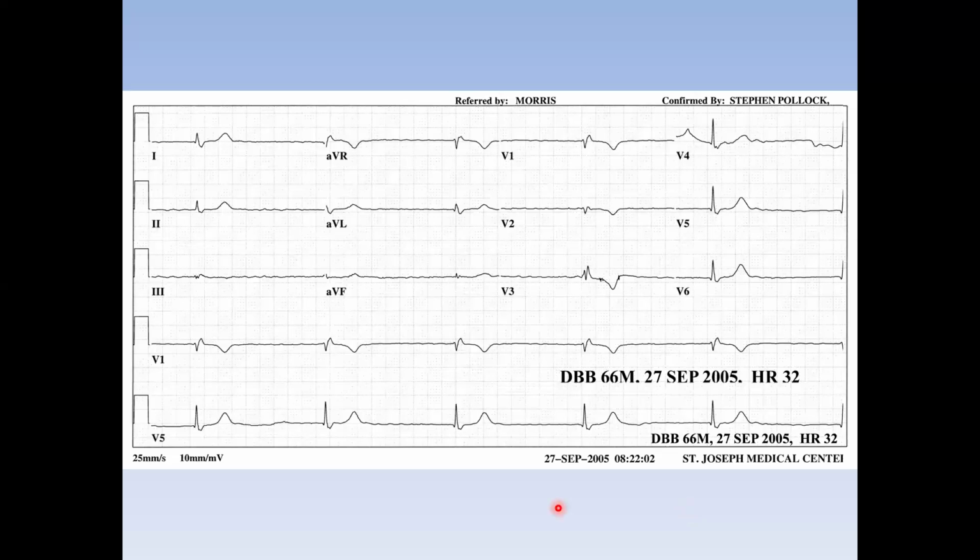So the question is, and this is for all the young doctors and everybody sitting there, that in atrial fibrillation, you expect the heart rate to be irregular. And if it is regular, our convention is this is complete heart block. Any proof of it, Dr. Shafiq? Ajoy will say that. Ajoy, so the fact that we call it complete heart block, is there any proof of it?